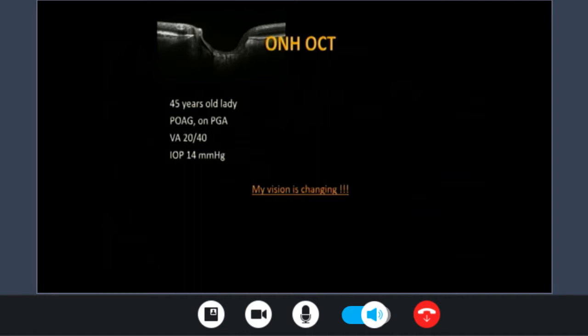So most of you now will realize that minimum rim width is an important and strong tool. Should it be used all the time? The answer is no. You need to use both parameters. The reason is the RNFL can sometimes detect early nerve fiber layer defects compared with the SDOCT on certain occasions, like in normal tension glaucoma patients.